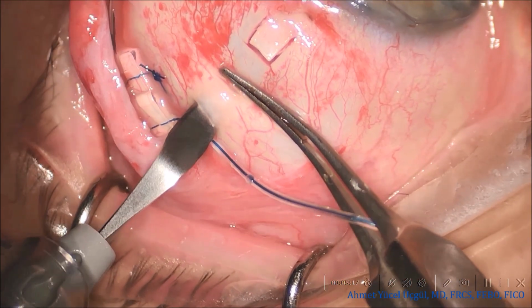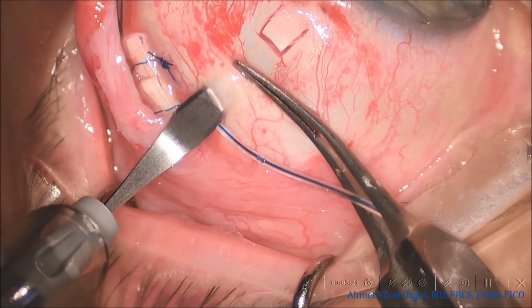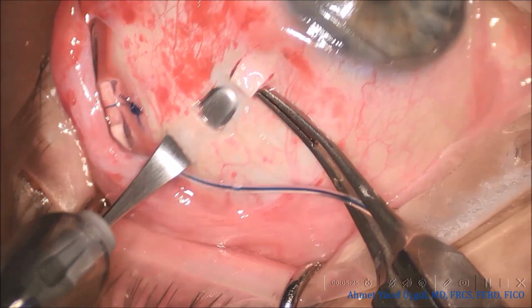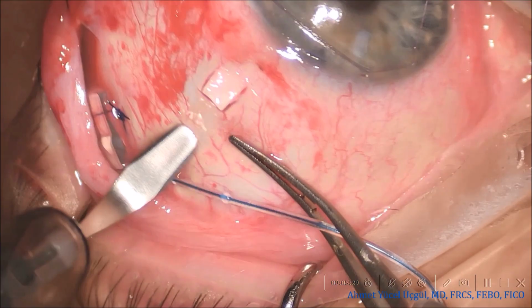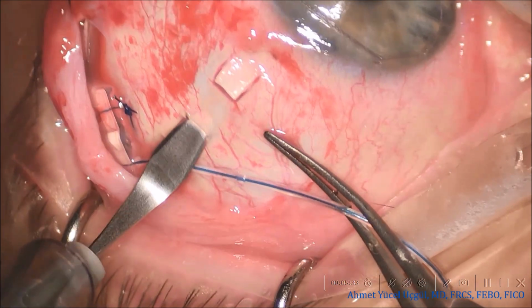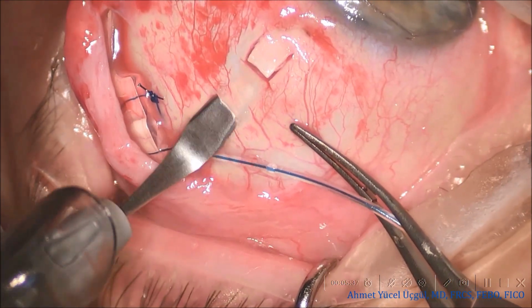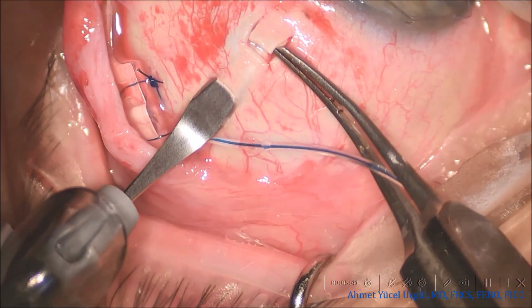First, the globe should not be overly tense because excessive scleral resistance may cause unintended deepening of the dissection and increase the risk of entering the suprachoroidal space. Second, once the crescent blade reaches the intended depth at the start of the tunnel, it should then be advanced parallel to the natural curvature of the globe. In my experience, these two principles are the key to avoiding inadvertent suprachoroidal penetration during tunnel creation.